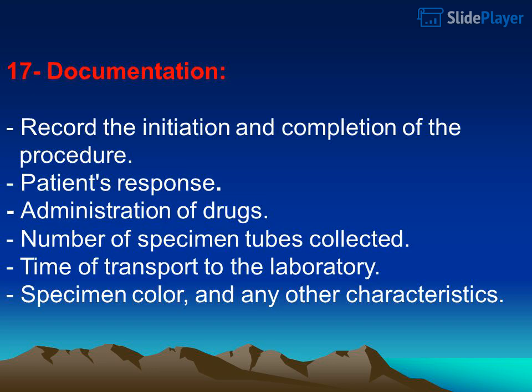17. Documentation. Record the initiation and completion of the procedure, the patient's response, administration of drugs, number of specimen tubes collected, time of transport to the laboratory, specimen color, and any other characteristics.